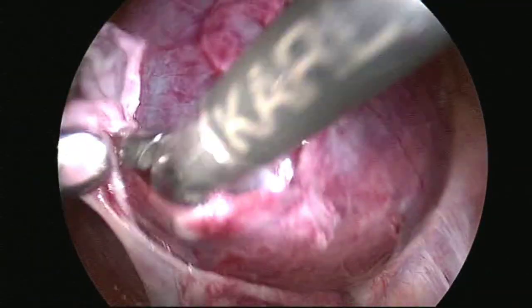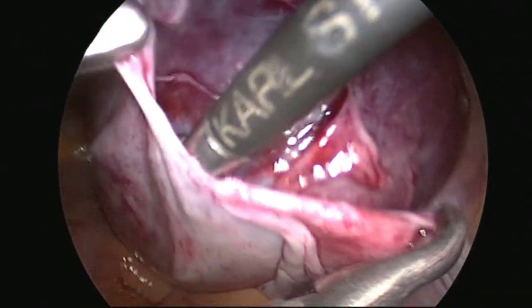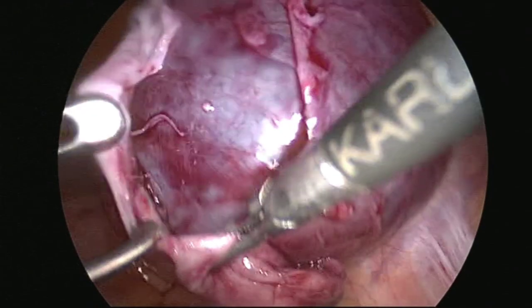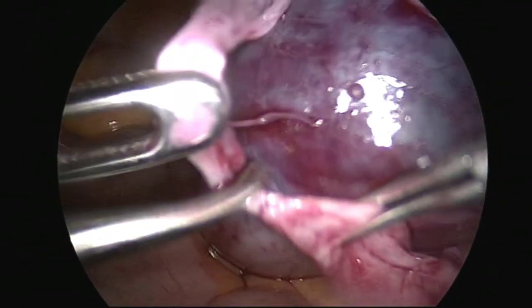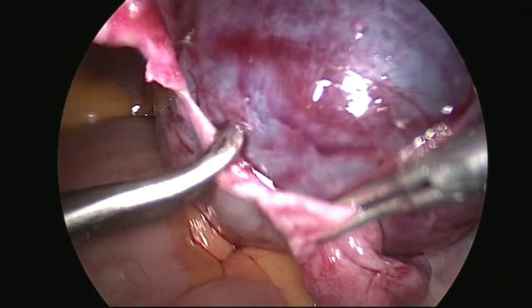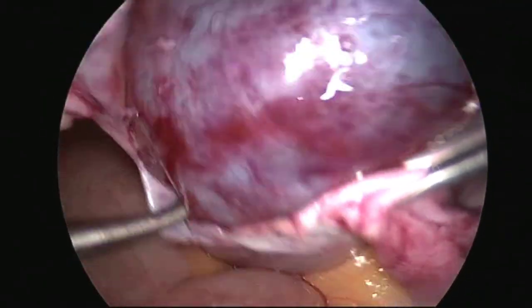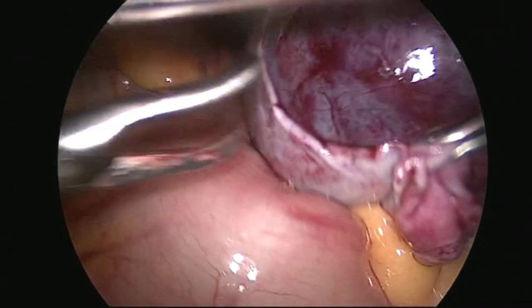Now in my mind only one thing is going on, that I don't have to rupture it. That is the only intention right now. After rupture of the cyst, it is too hard to separate the cyst wall because that is very fragile. Okay.